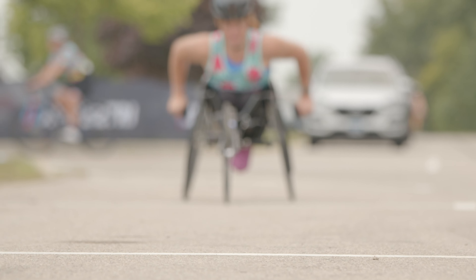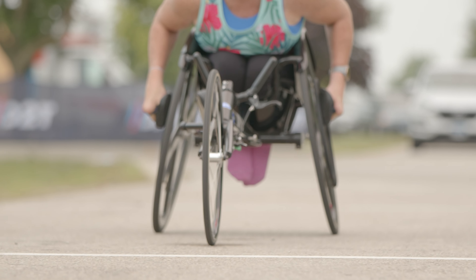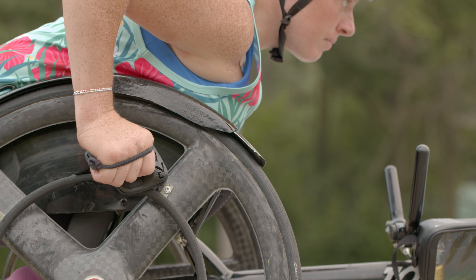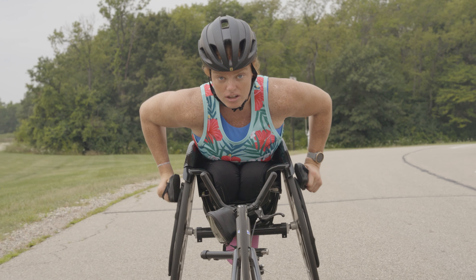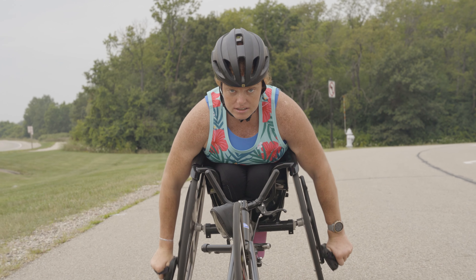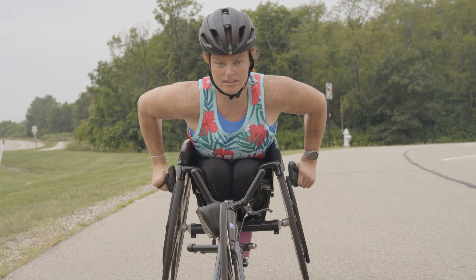Starting and stopping are essential skills, not only for optimizing performance, but also for ensuring safety. To get the wheels turning, use the push-start method. This involves propelling the wheelchair forward by placing your hands on the push rim and generating enough force to accelerate from a standstill.